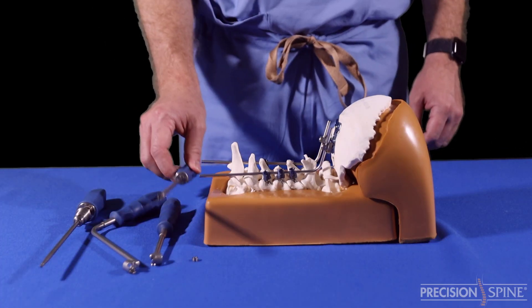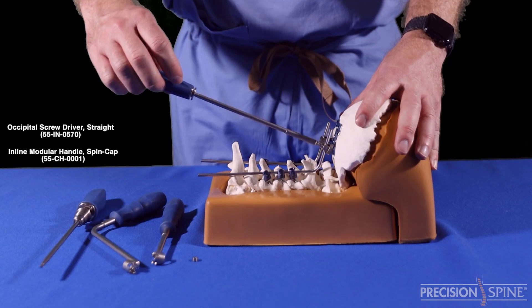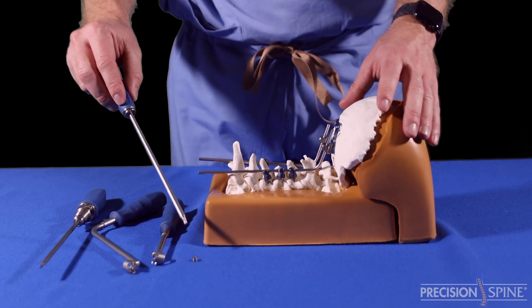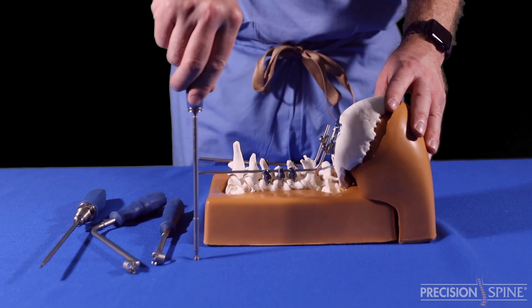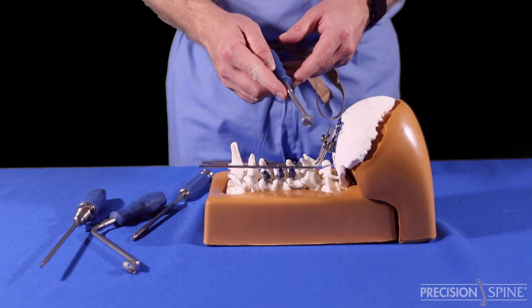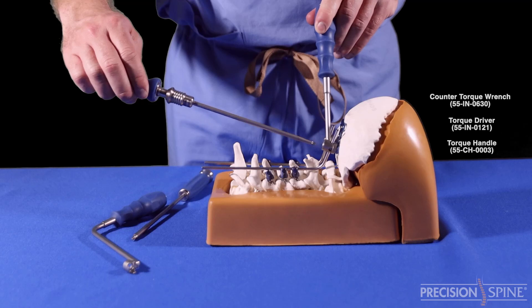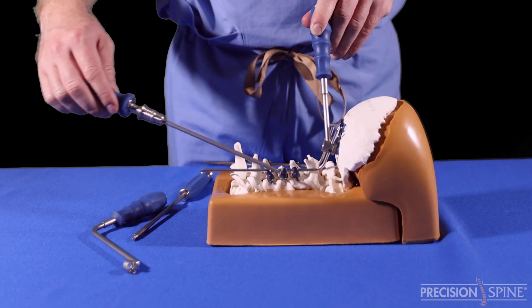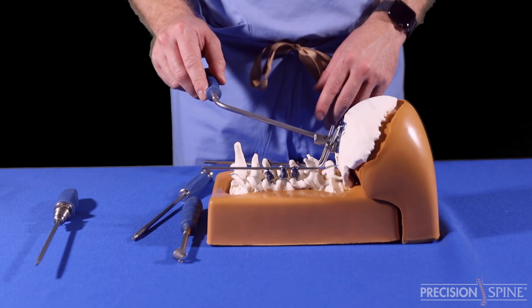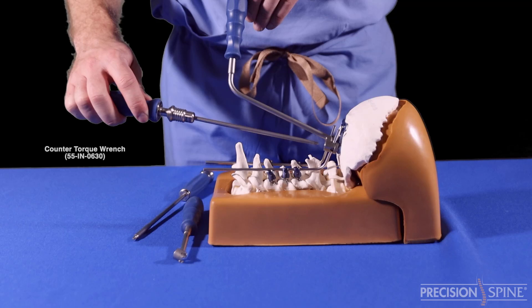Use the occipital screwdriver to deliver a set screw to tighten the rods down. Lastly, final tighten each cap screw using the occipital counter torque wrench and inserting the torque driver. There are two different counter torque wrenches that can be utilized. Once engaged with the set screw, tighten until clicking is heard.